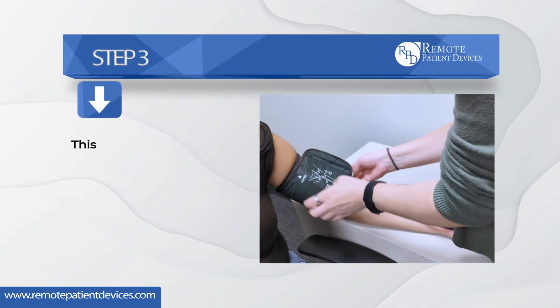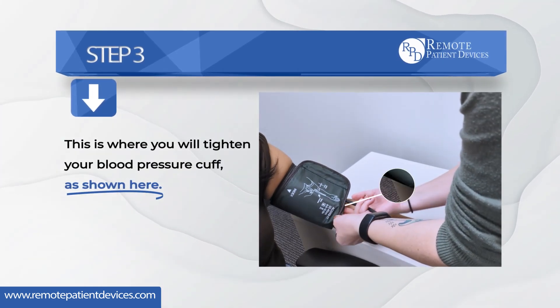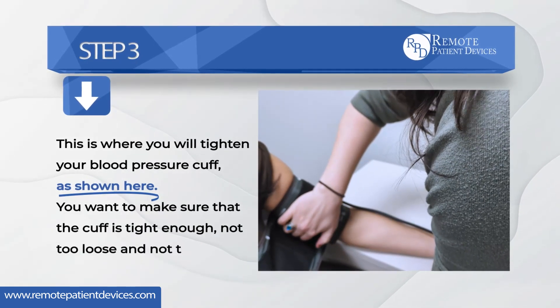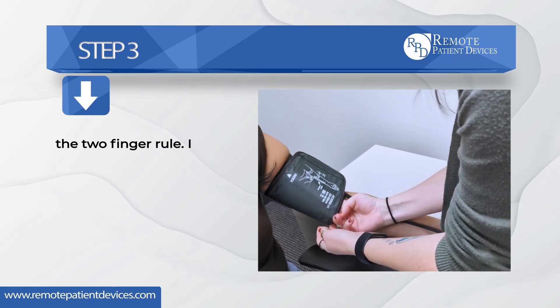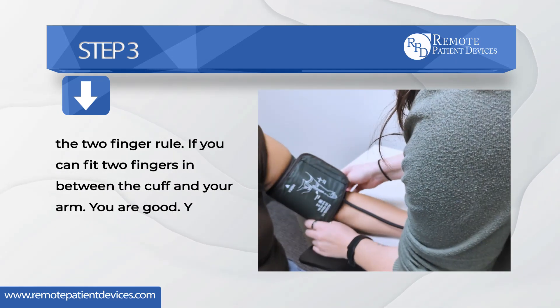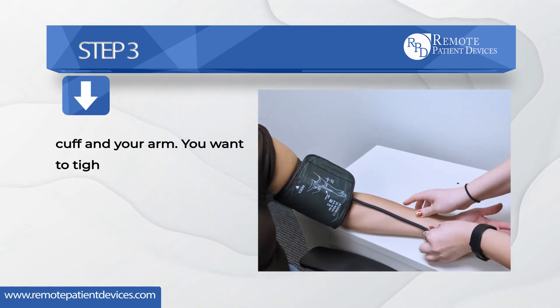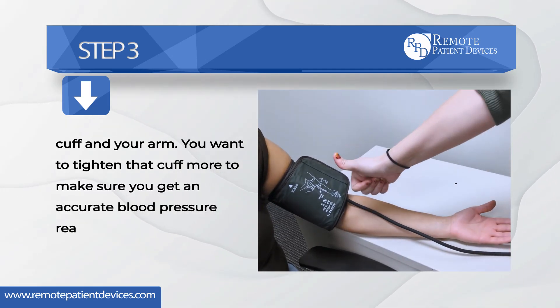Step three — this is where you will tighten your blood pressure cuff as shown here. You want to make sure that the cuff is tight enough — not too loose and not too tight. We'll follow the two-finger rule: if you can fit two fingers in between the cuff and your arm, you are good and can go on to step four. If you can fit more than two fingers, tighten the cuff more to make sure you get an accurate blood pressure reading.